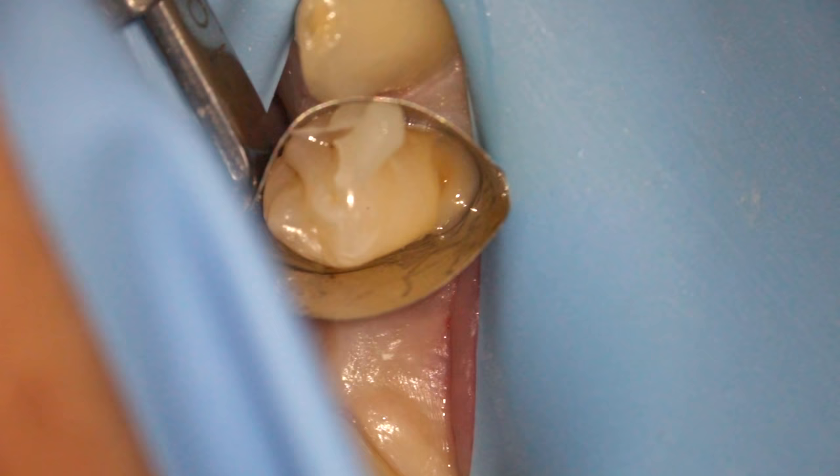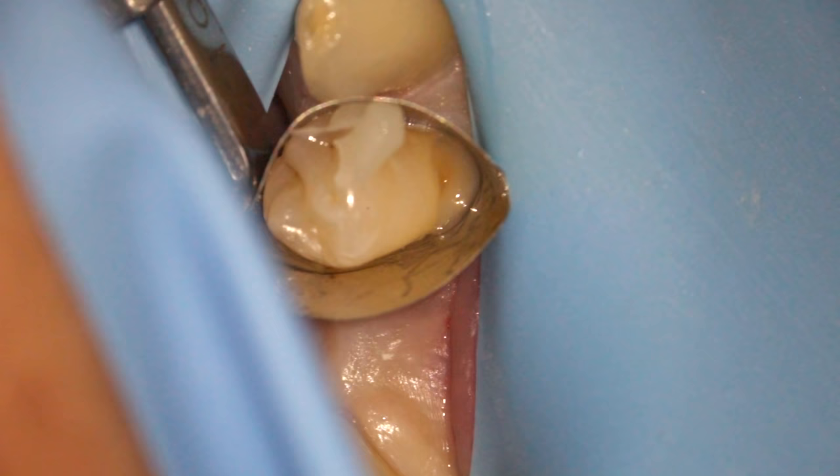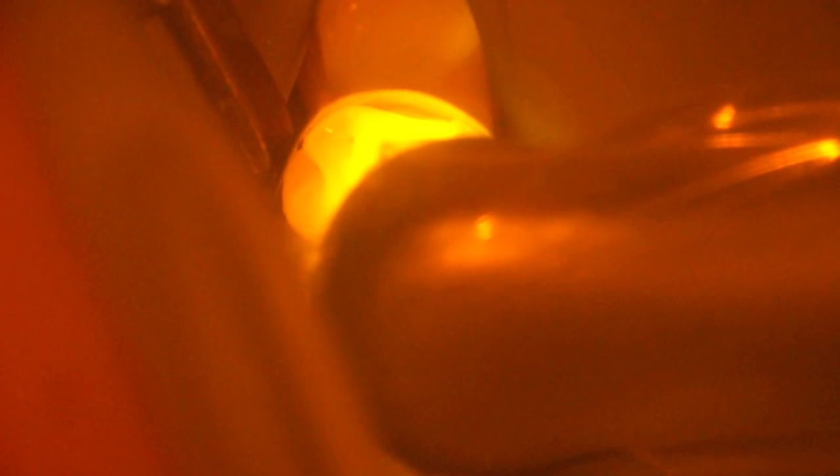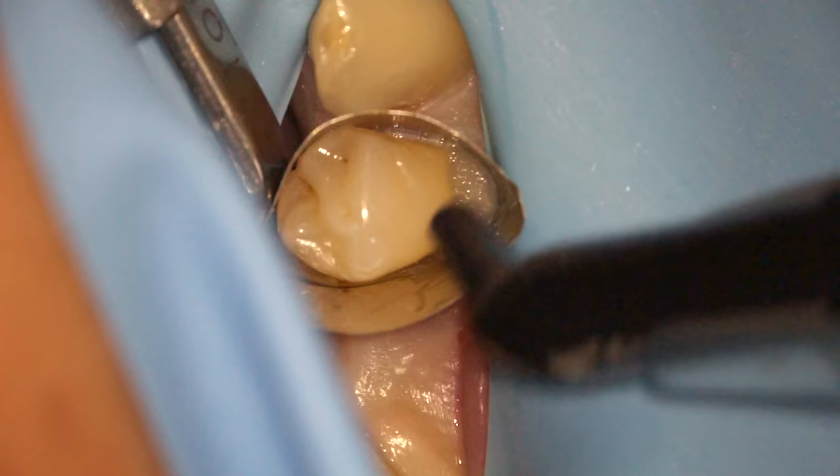I use a normal paste-like composite for the rest of the filling. We put it in in smaller increments to make sure that we don't get too much shrinkage as we cure each increment. I'll put that increment in, then put one more in, and for the final increment I spend a little bit more time shaping it.